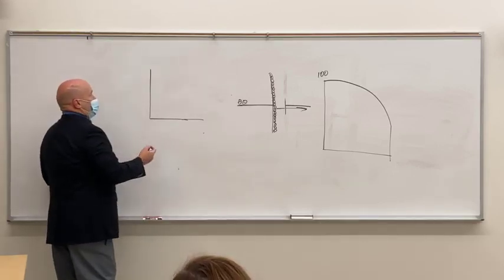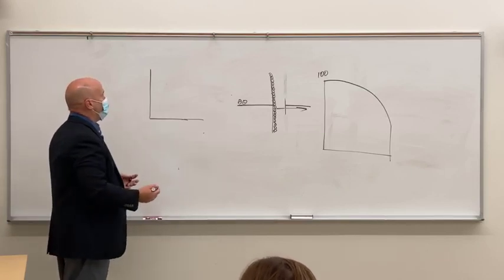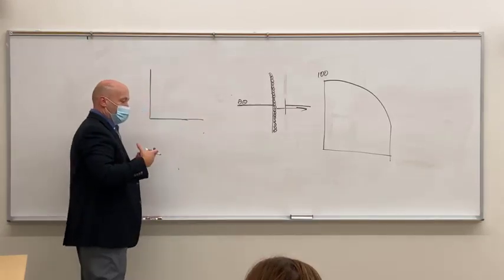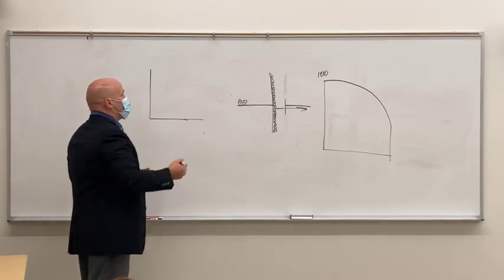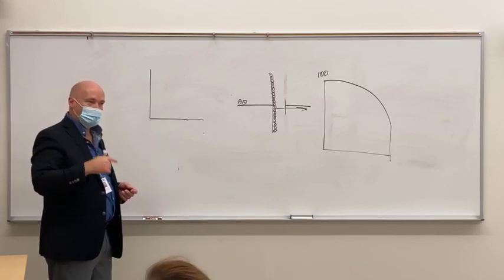So let's say you're making a big exposure. It doesn't even have to be a big exposure. Let's say you're doing, I don't know, cardiac catheterization, and you need to make an exposure. So what it's going to give you is the highest possible mA that the machine can give you.